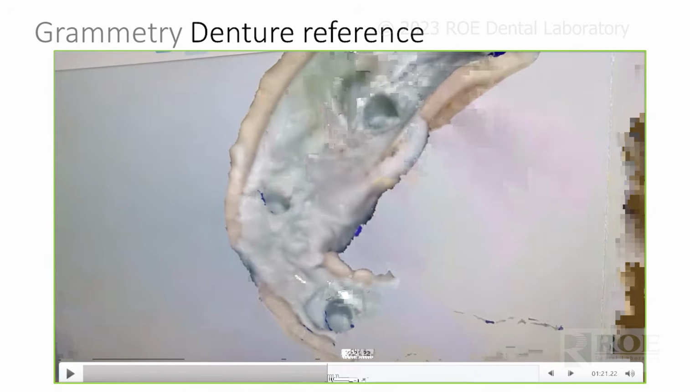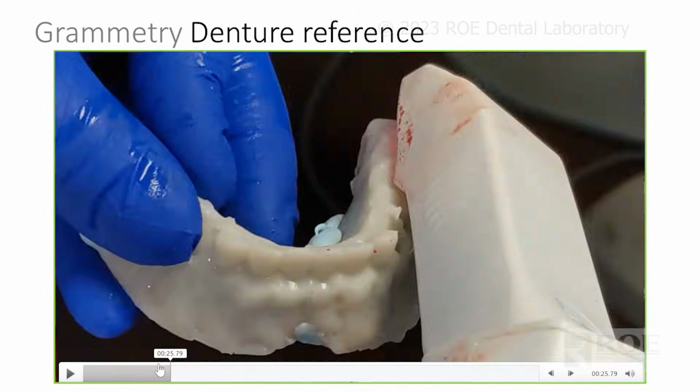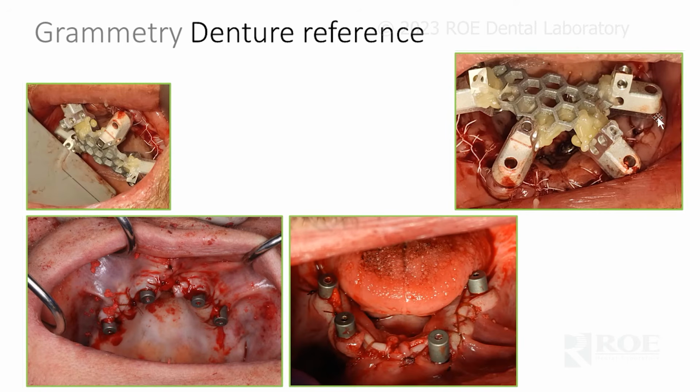All right, and then you hold them together. Now you have... I just scanned the whole thing. I don't know why I scanned the whole thing, but you have two options at this point. You can either reinsert them back into the mouth to scan the bite, which probably will not be comfortable for the patient, or just hand hold them and scan the bite. And now we have everything we need to virtually articulate the case and marry with the upper and lower representations of the MUAs, the OptiSplint scans.